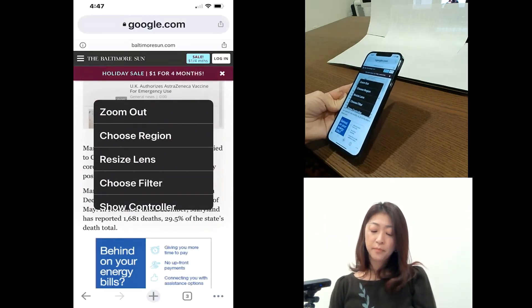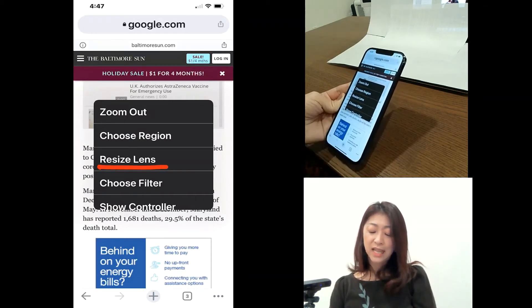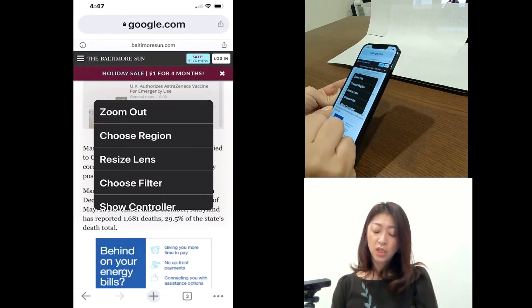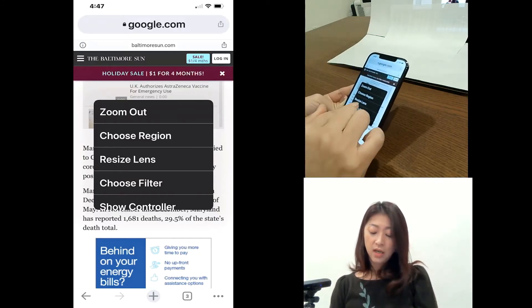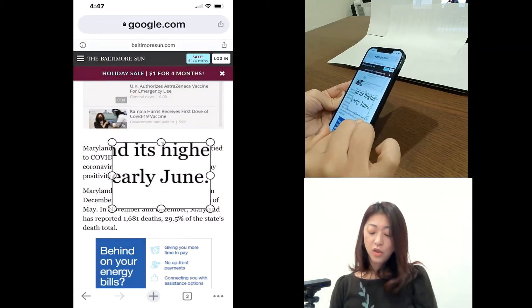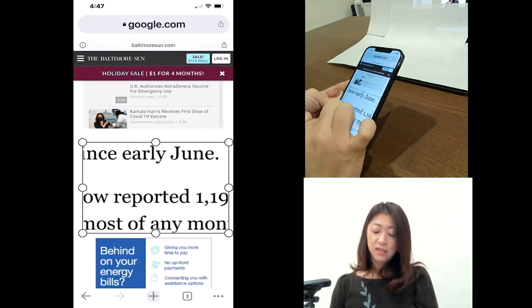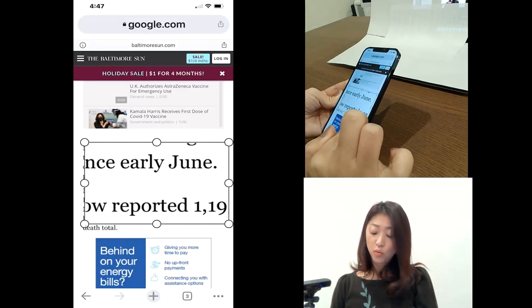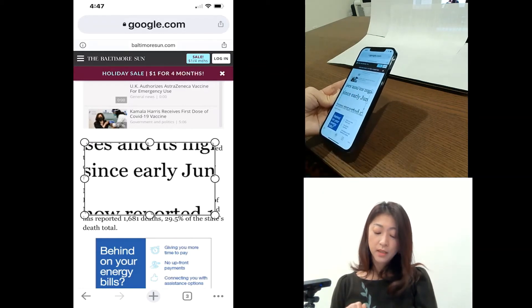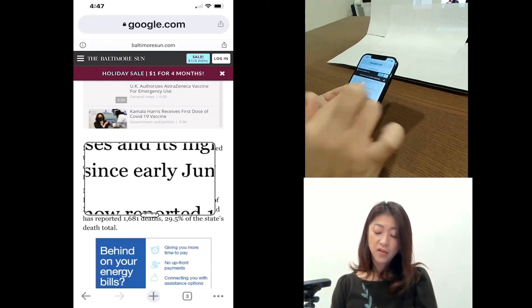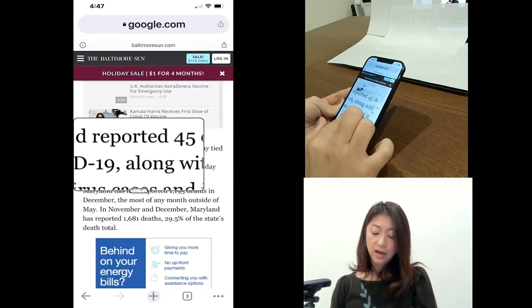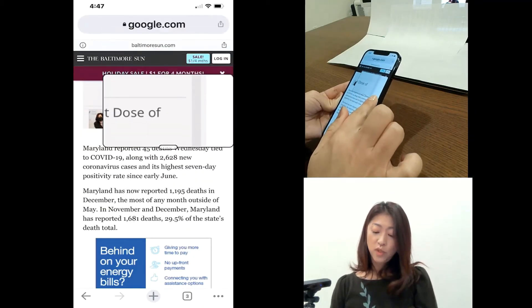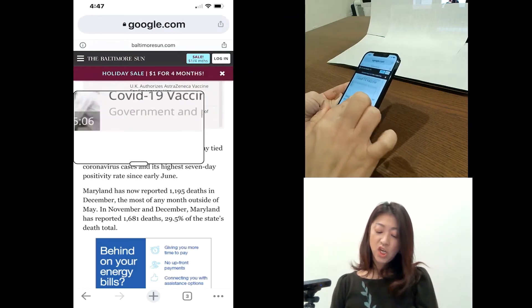Okay. And then right below that, it says resize lens. You will get this menu only when you have the window zoom picked. So if I tap resize lens, you can resize the size of zoom window. Okay. And then I can tap outside of the window to exit out. Then now the zoom window size is changed.